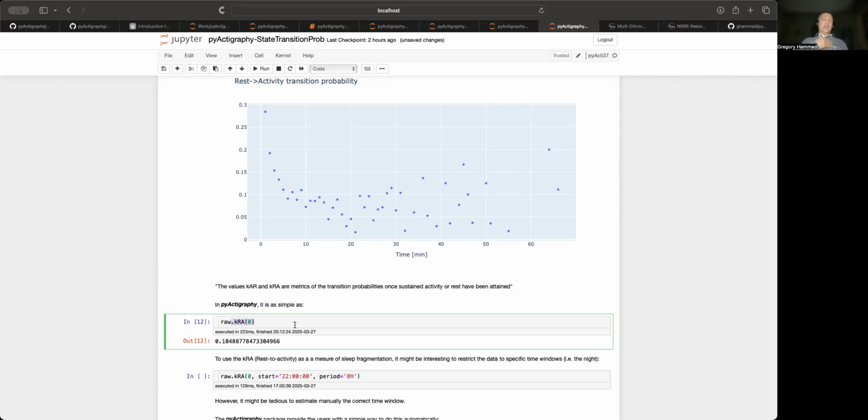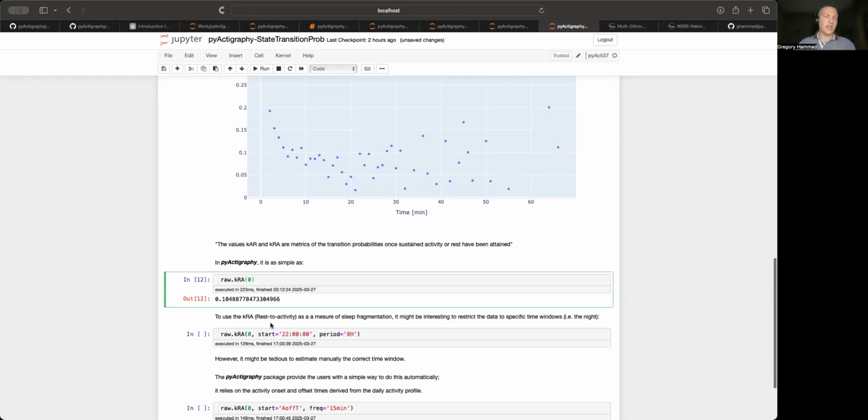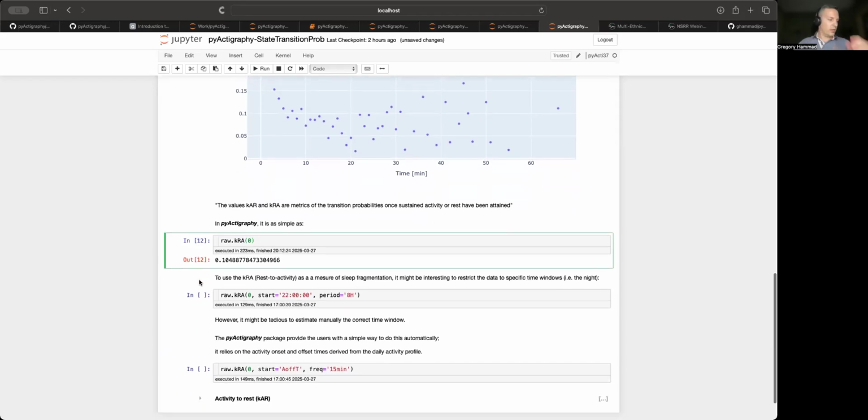And here it is. And the nice thing is it was shown that this metric correlates, obviously, with aging, but it also correlates with the incidence of neurodegenerative diseases. So that's why they implemented that. I think it was the aim. So that's why I like that one. It makes sense from the physics point of view, or at least it's more suitable than the definition that I've seen so far. So this one is a good one.